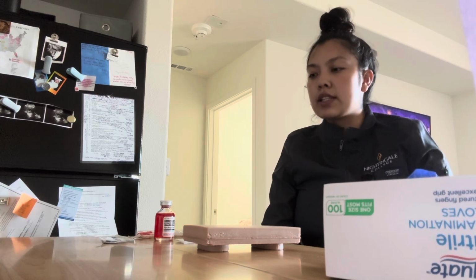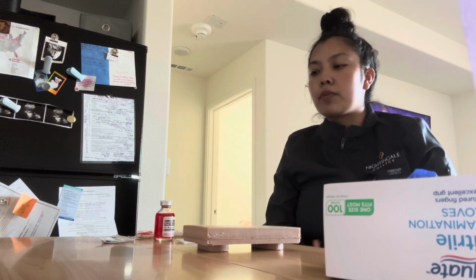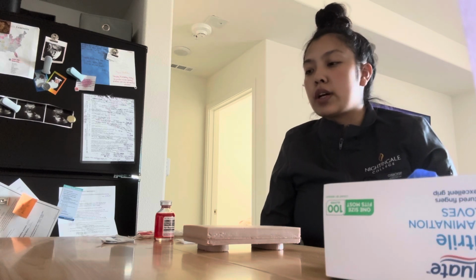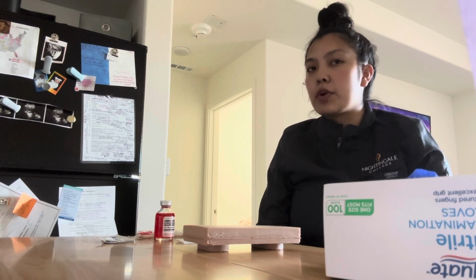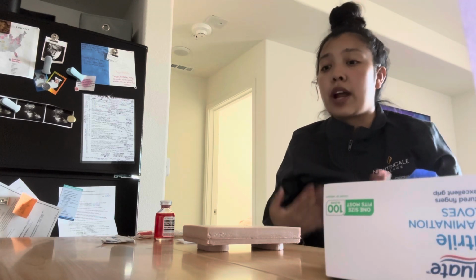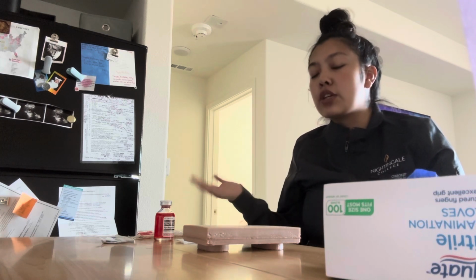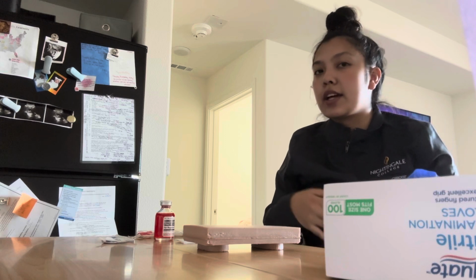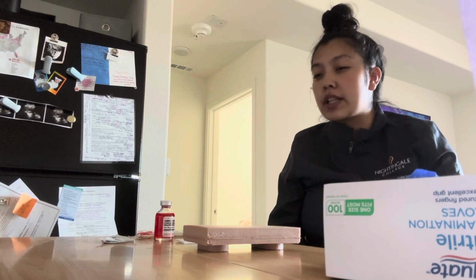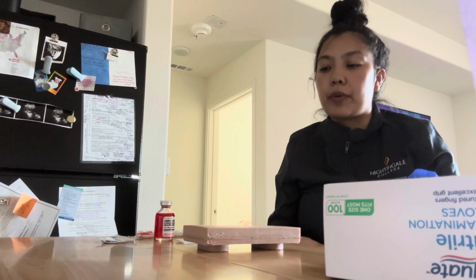No? Okay, so basically a TB test is, I'm going to be injecting some medication into your forearm that is going to be testing to see if you have a reaction to TB. There are some common side effects like redness and swelling or itching and irritation. When I get the TB test for work, I get some itchiness. When I do inject it, you will feel a slight burning and slight stinging sensation. But if you start to feel like excess swelling or if you have a large lump that's causing you severe pain, you need to let someone know right away, okay?